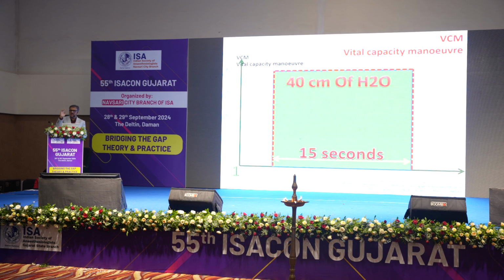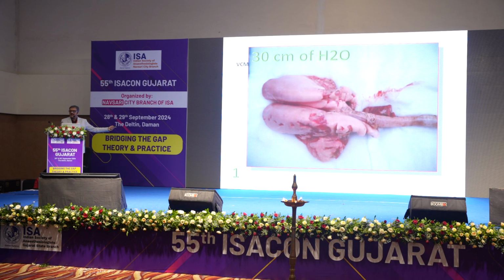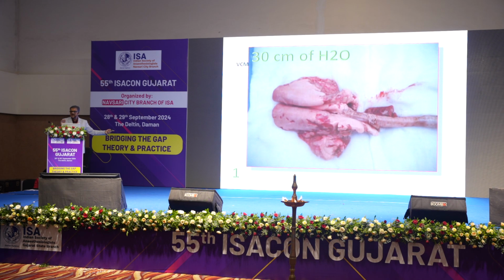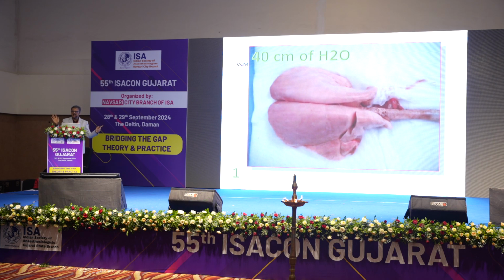So it's a high pressure of 40, and it will be done in a paralyzed state. If you are delivering 30, still atelectasis will be there. It reduces the atelectasis, but atelectasis will be there. If you do it with 40 pressure, look at the lung, completely open lung.